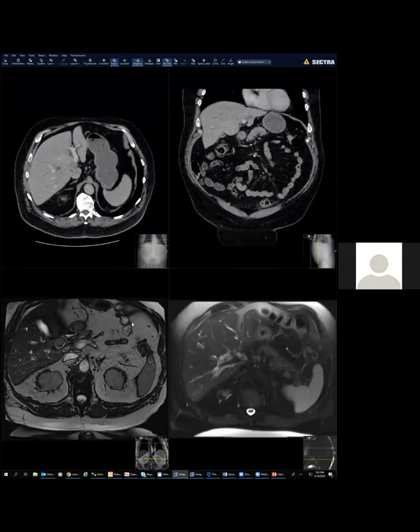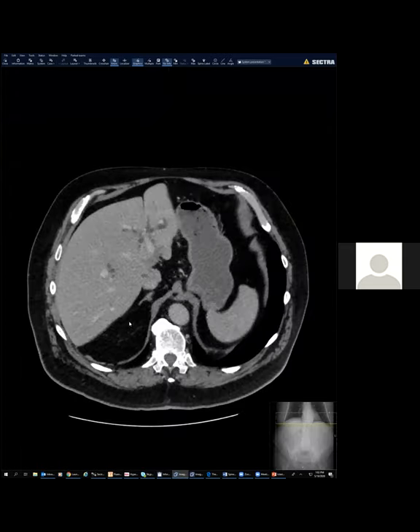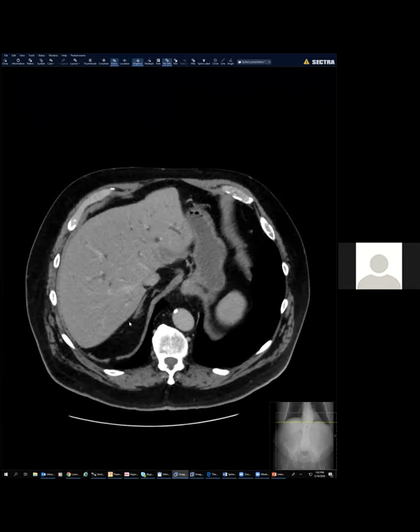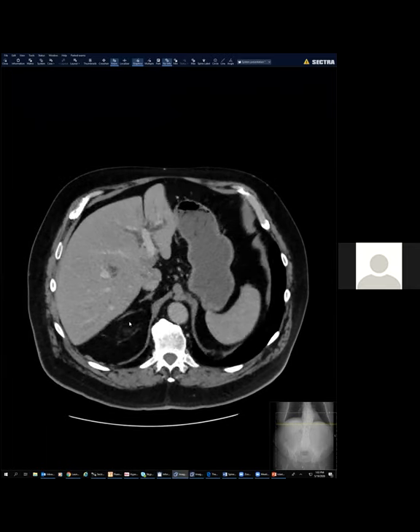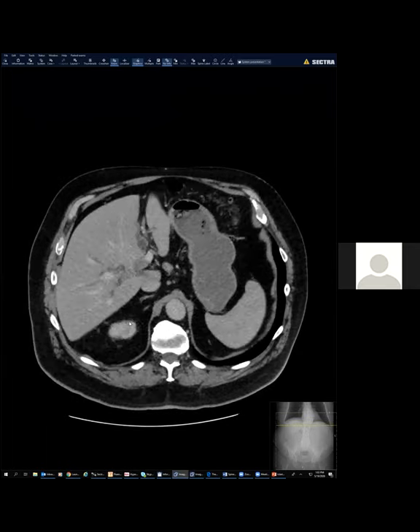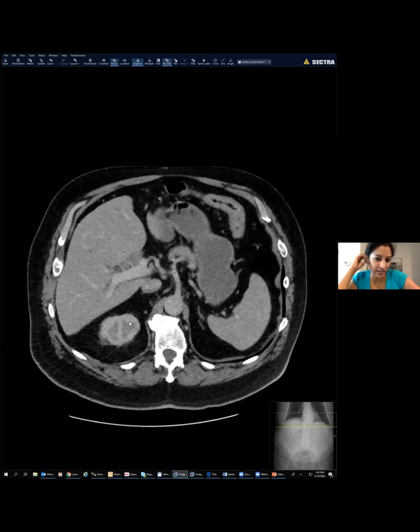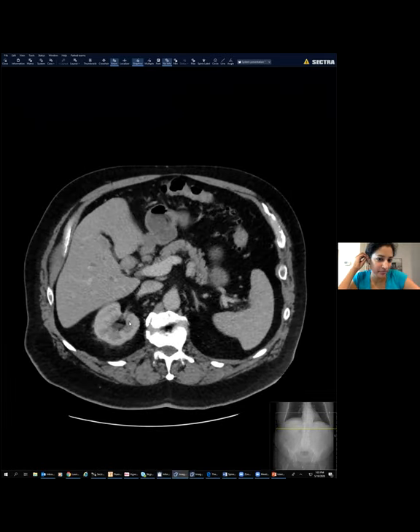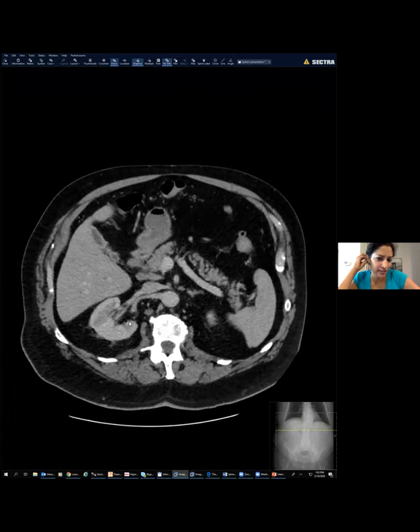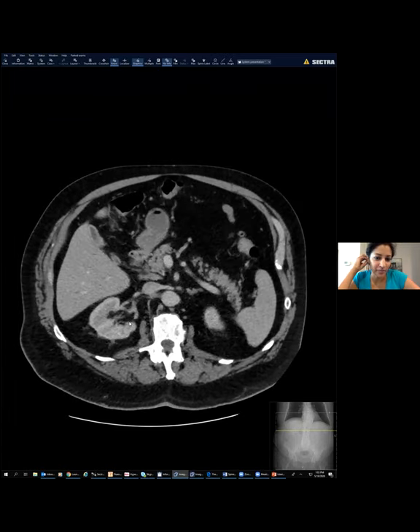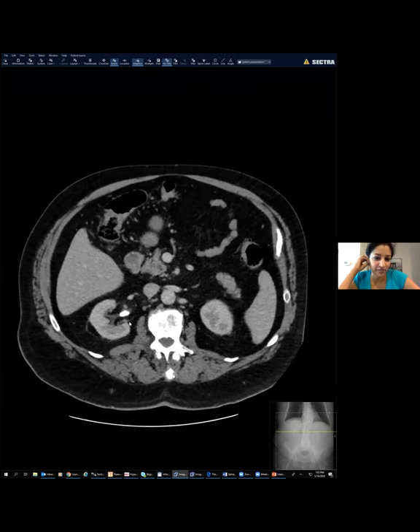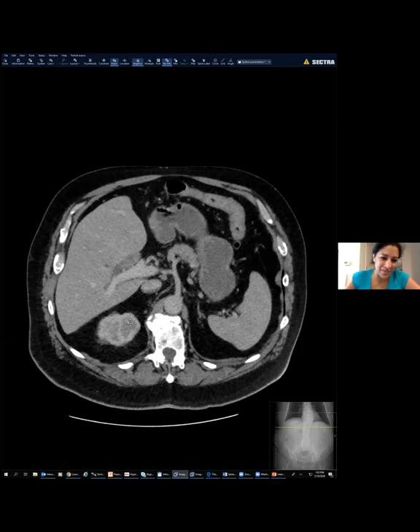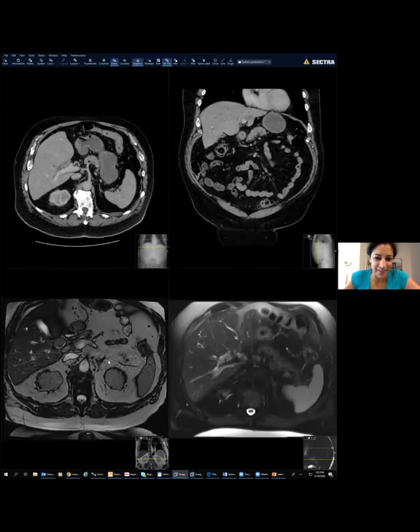Just showing you an axial view. Starting at the top, I see biliary dilation and then something in the region of the hilum. This is reminding me of one of Gitanjali's cases — it looks like maybe there's some expansile thing in the CBD.